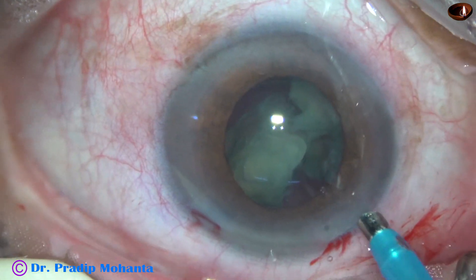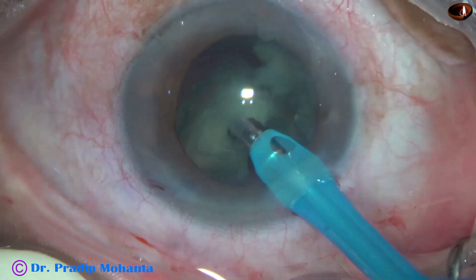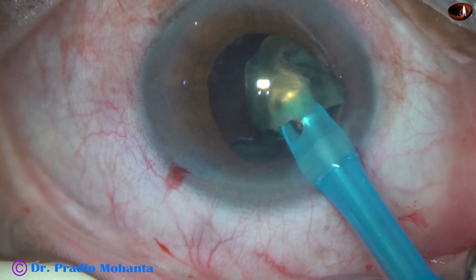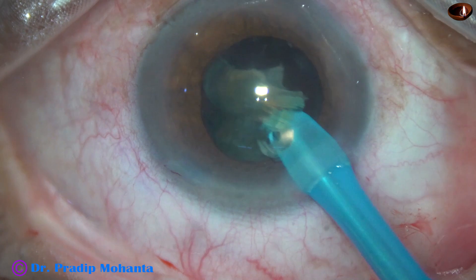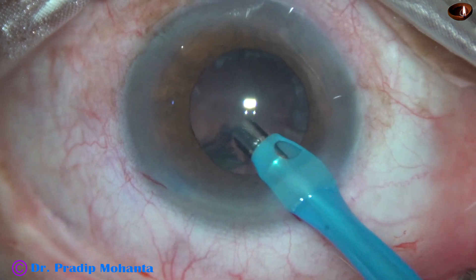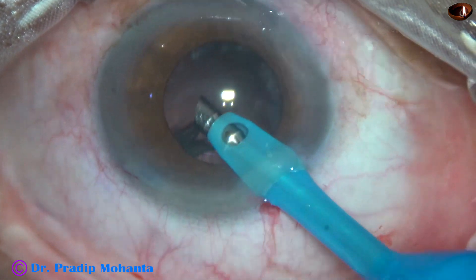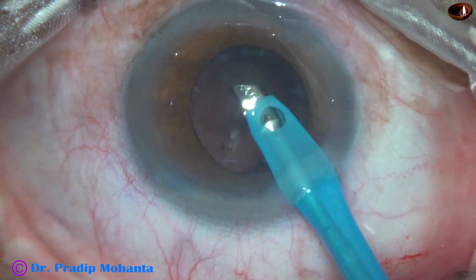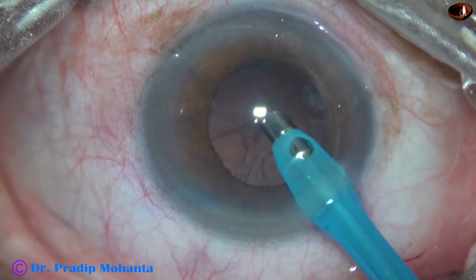Now I inject viscoelastic, and as I go in with irrigation, the pupil dilates a little more — and yes, it has dilated a little more. We can manage without using the chopper further. So in this case, what I did differently is I used the pre-chopper to manage this case of IFIS. And the result? I could manage the case without using any iris hook or any pupil expansion ring.